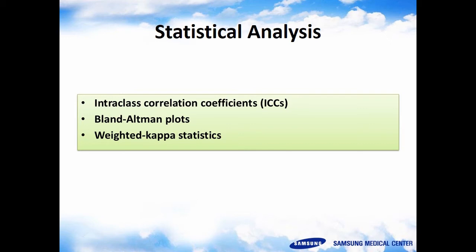Bland-Altman plots were constructed to facilitate the assessment of the sources of disagreements. The qualities of the 2DP and 3DP images were compared using weighted kappa statistics, which adjusted the unweighted kappa for asymmetry of the two-way table for image quality rating data. The various ICCs and image qualities were compared using 2 sample t-tests, applying the central limit theorem for large samples.